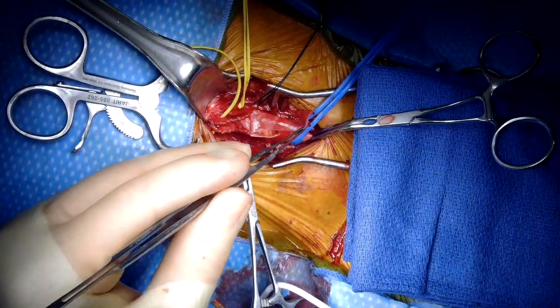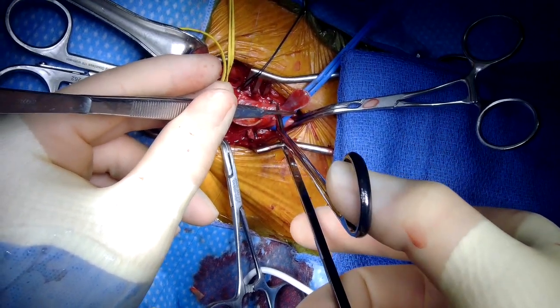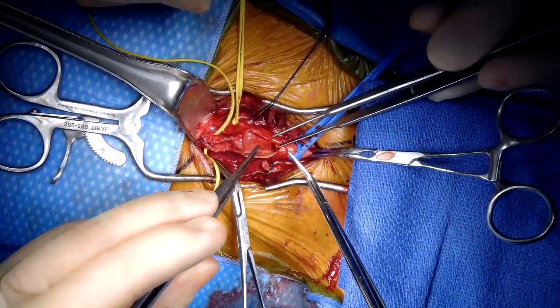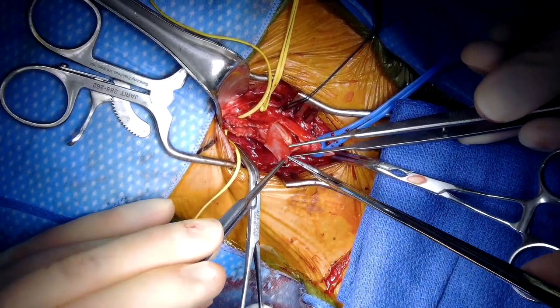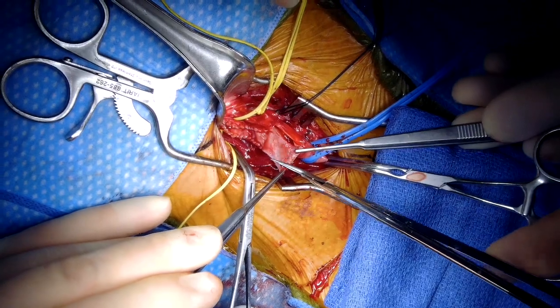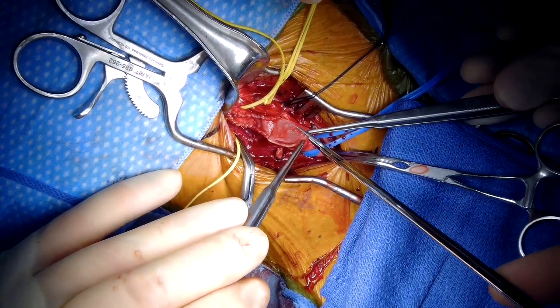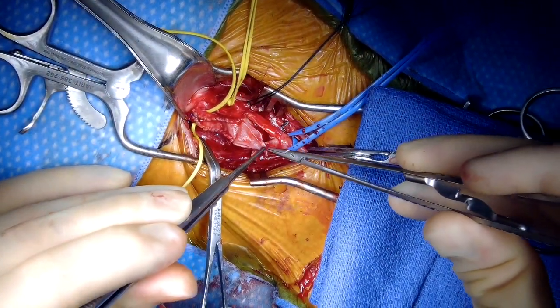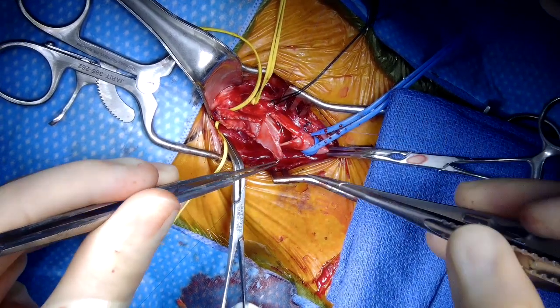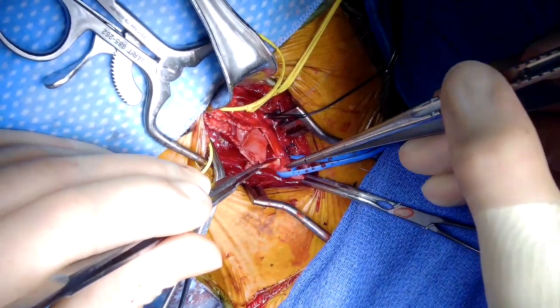The patch was trimmed to the appropriate length and size. A second 6-0 Prolene running suture was initiated from the common carotid artery origin of the arteriotomy and run toward the midpoint on both sides of the arteriotomy.